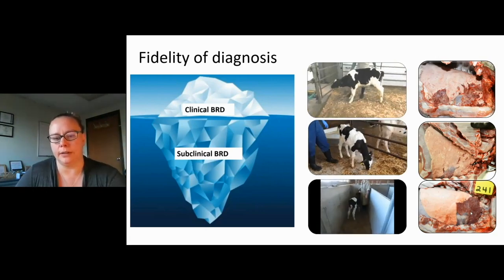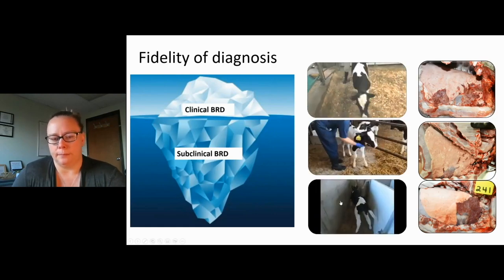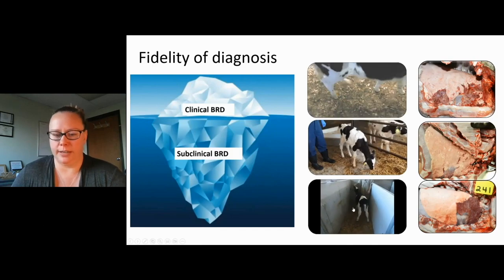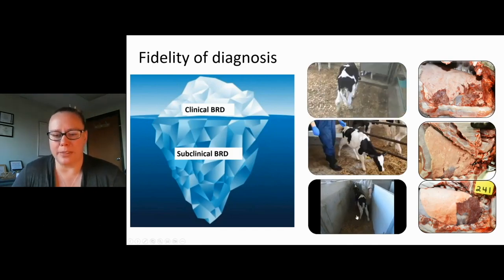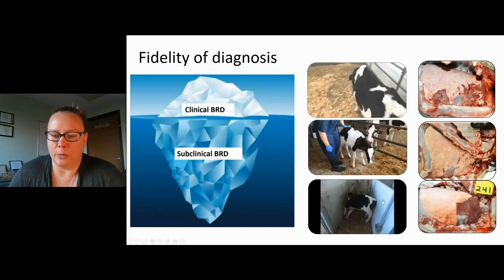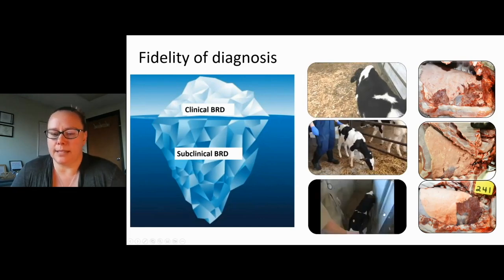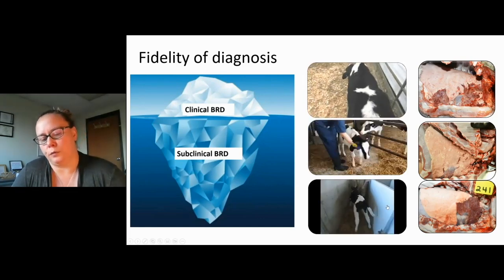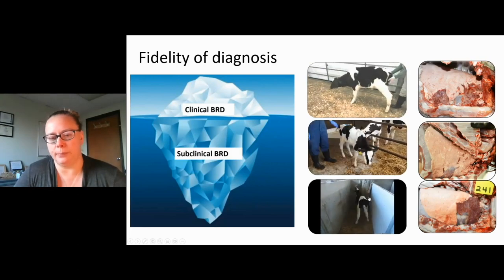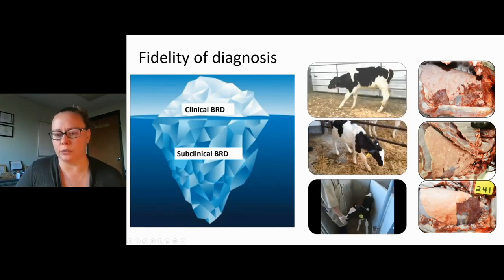This third calf down here on the bottom, this is what subclinical pneumonia looks like, right? You can't pick them out. Right? They are prey species. It's part of my rationale for why calves do this. They don't want to tell you they're sick, right? Way back when they were trying to prevent themselves from being chased down by some wild predator, they didn't want to give any indication that they were sick, okay? I think that's probably why we see subclinical disease in these animals, because they are trying to hide the fact that they're not so fit, right? And we can't shame farm employees, we can't shame veterinarians for not picking up on these clinically because they just don't have clinical signs to tell you that they're sick, but yet they can have extremely abnormal lungs.